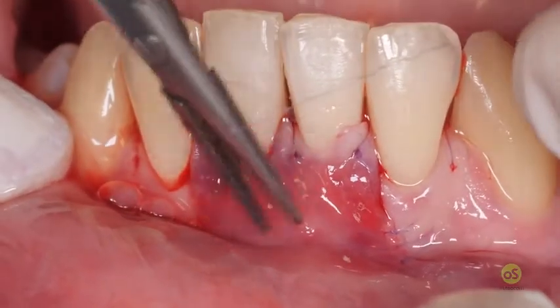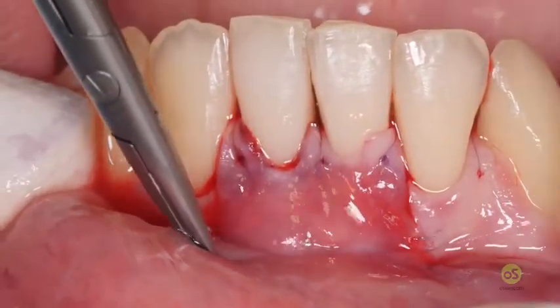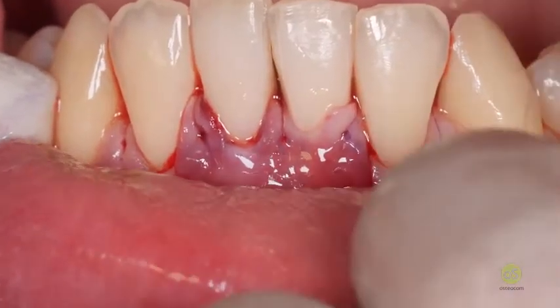All this suture has a periosteal anchorage in the area where the muscles has been physically removed, and so this flap can be attached to the verticality of the periosteum.